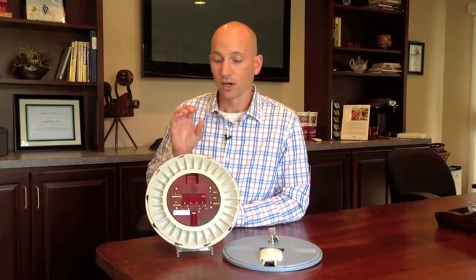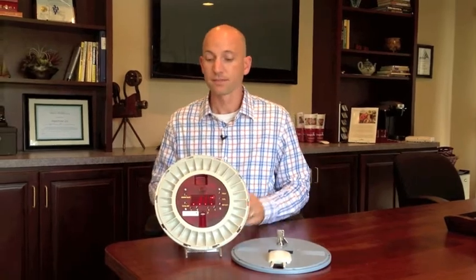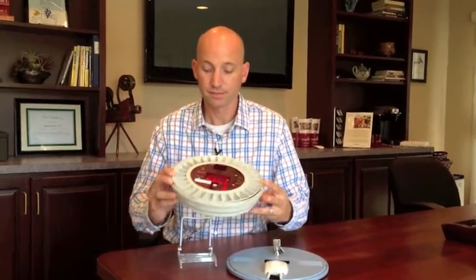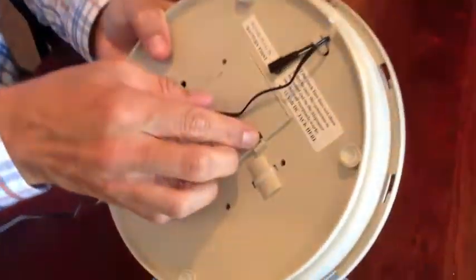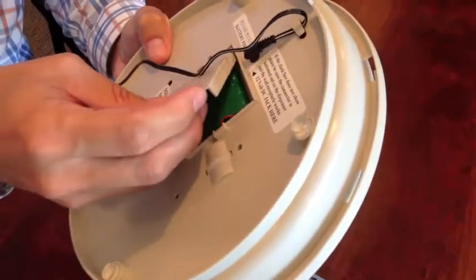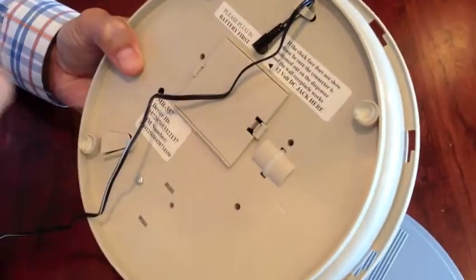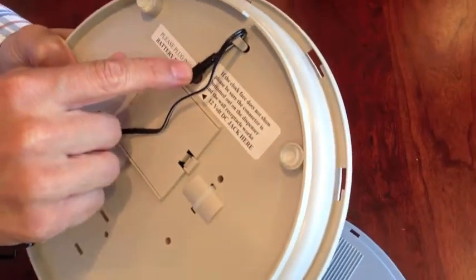Most of the features of the cellular medication dispenser are similar to the landline version with a few differences. First is the actual startup procedure. Just like on the landline version, you're going to want to put the battery in first. This battery is already in, but you simply plug the battery in after you take it out of the box, replace the cover, and then just like on the landline version, you want to plug the power in here and make sure it's plugged into the wall.